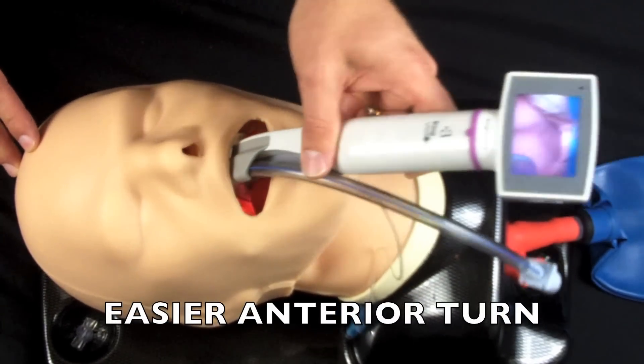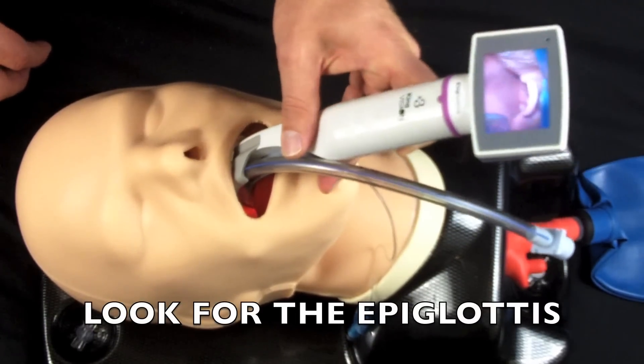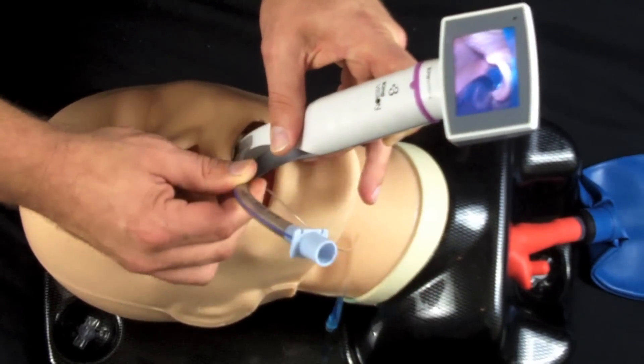So at this point, as soon as we see that epiglottis — and make sure you see the epiglottis every single time — I'm going to go into the vallecula, let it open up, and we slide it right in.